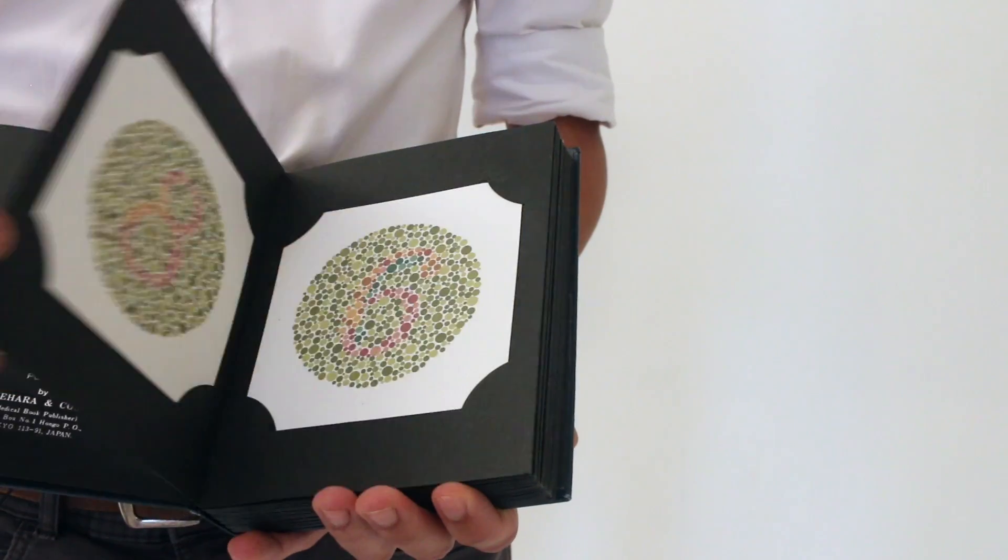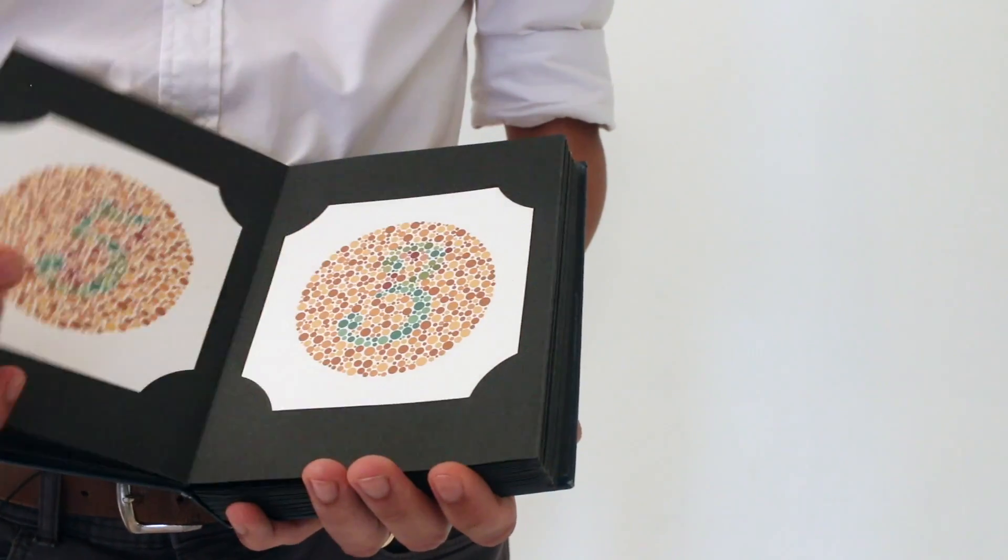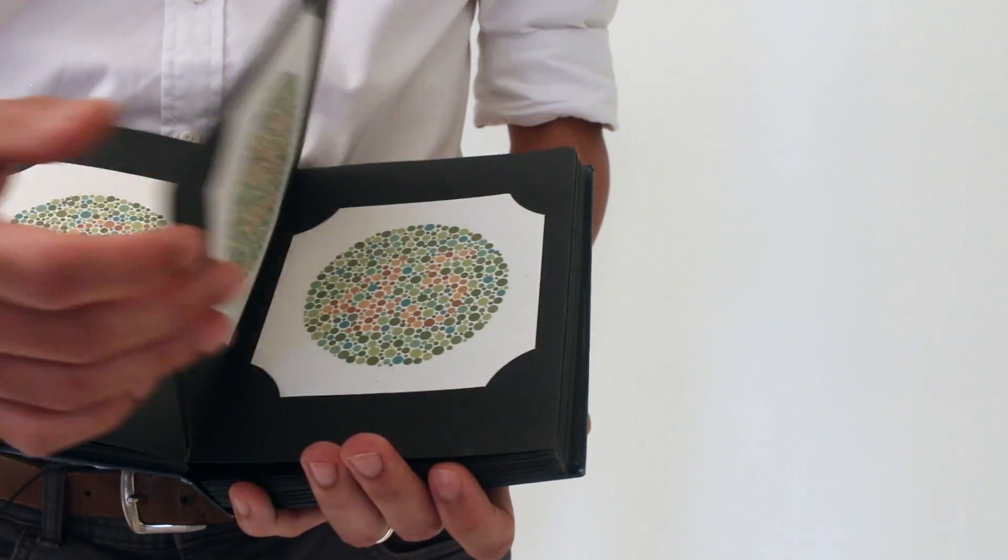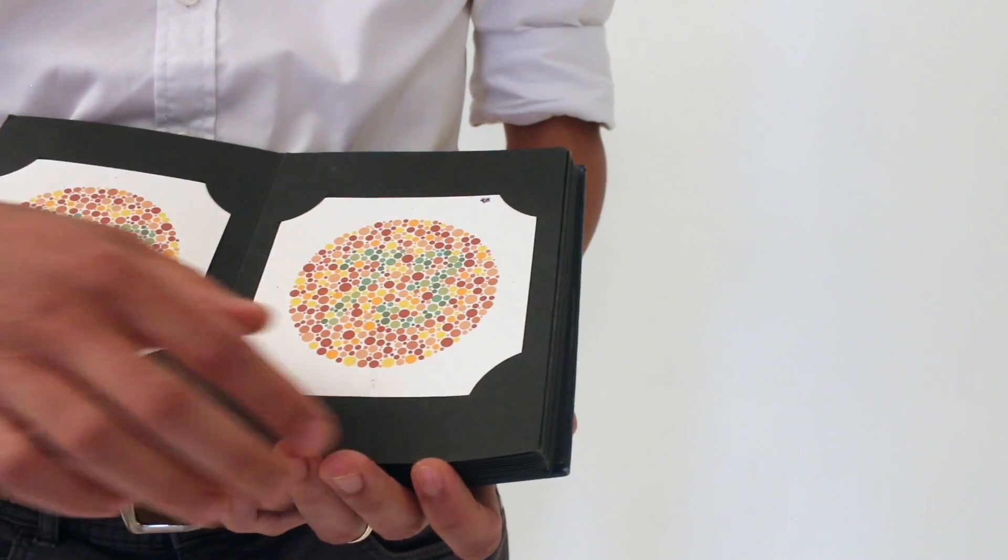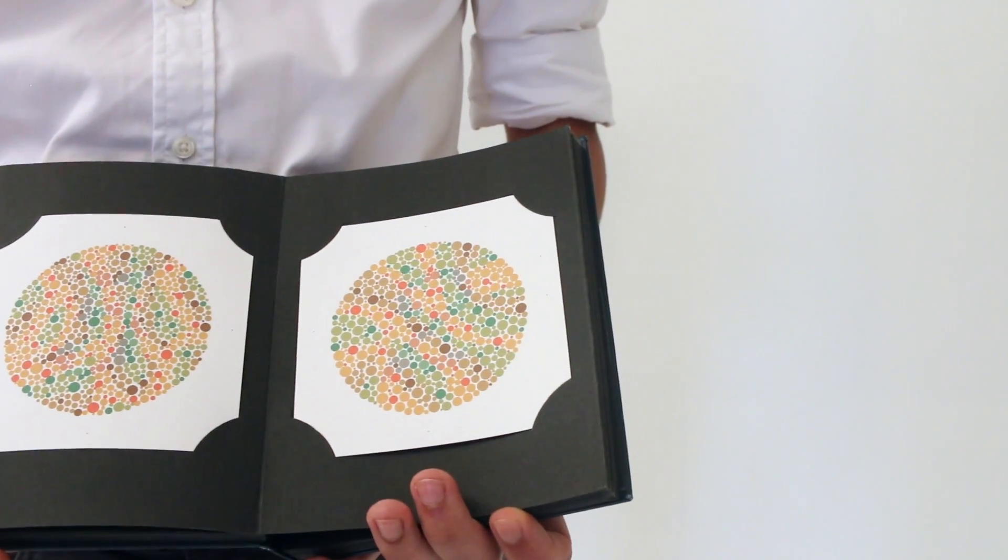You test one eye at a time, going through all the numbers until you get to the page where there is no numbers. Like that. And then you stop and you can test the other eye.